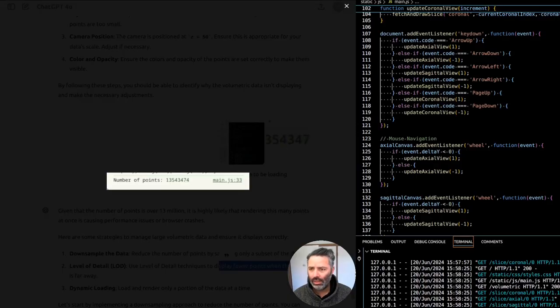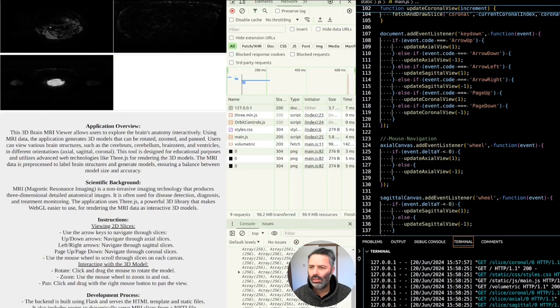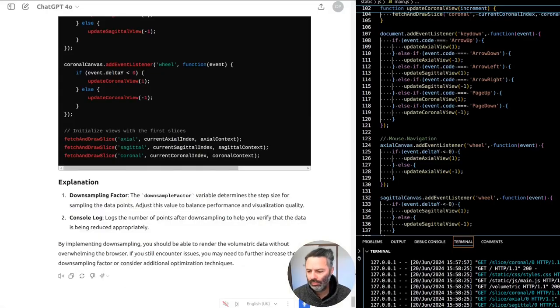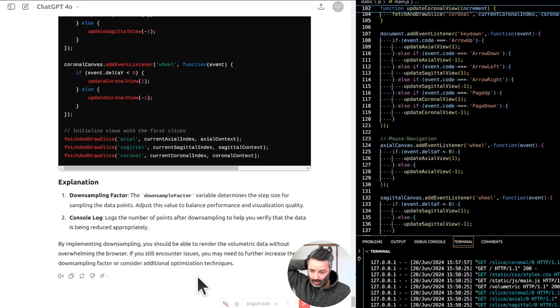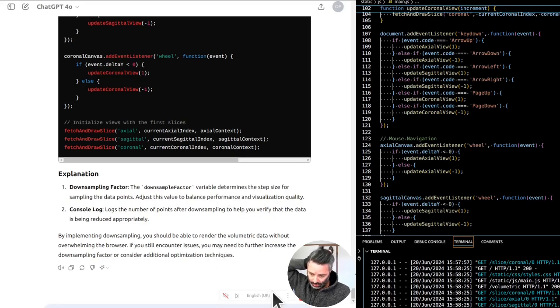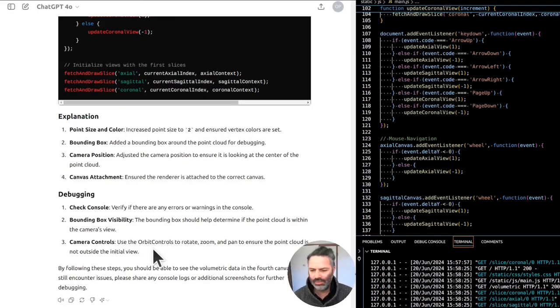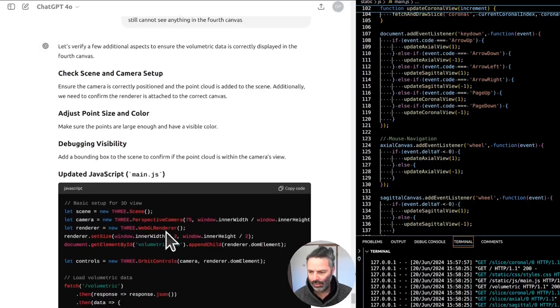After downsampling, there are much fewer data points which is great, but I still cannot see anything in the fourth canvas. Let's verify a few additional aspects: check scene and camera setup, ensure the camera is correctly positioned and the point cloud is added to the scene, confirm the renderer is attached to the correct canvas, adjust point size and color, and add a bounding box to the scene to confirm if the point cloud is within the camera's view.